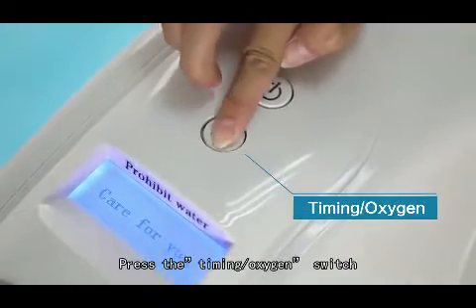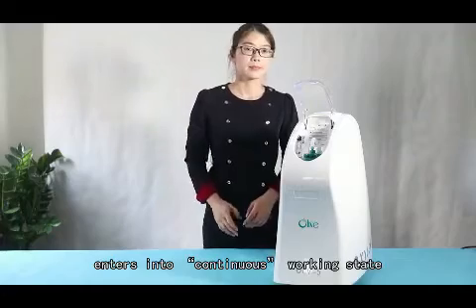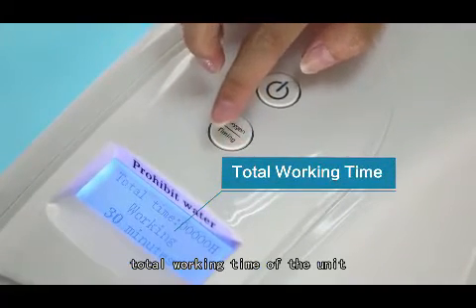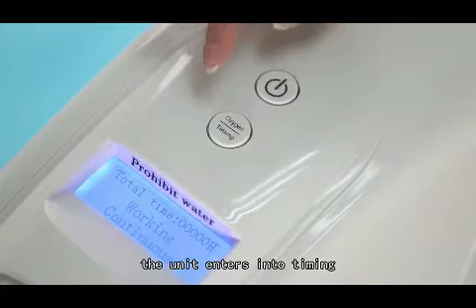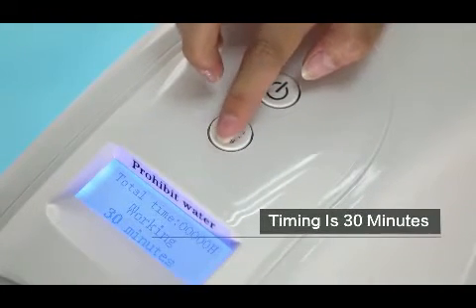Press the timing oxygen switch. The unit will start and enter into a continuous working state. The display will show the total working time of the unit. Then, press the timing oxygen switch again. The unit enters into timing state, and the timing is 30 minutes.